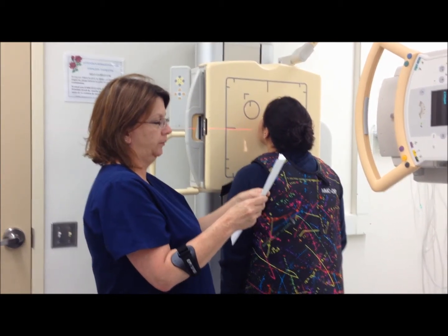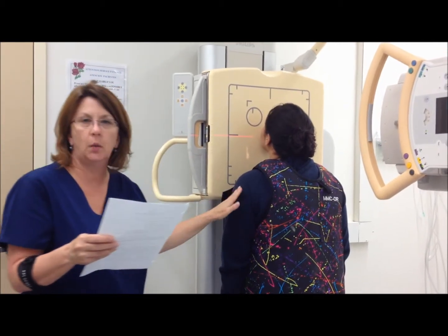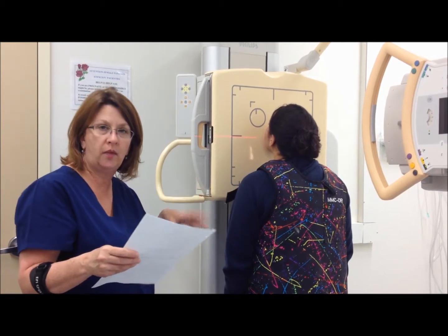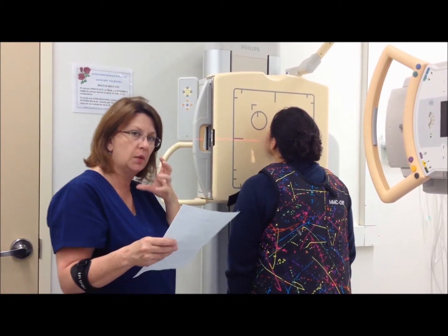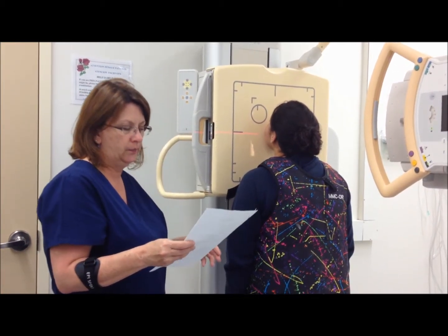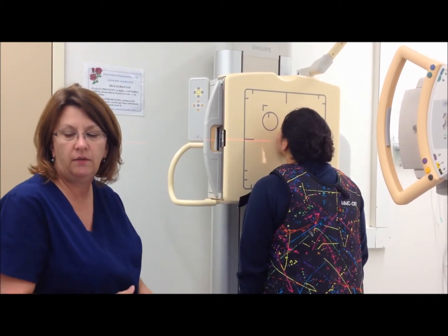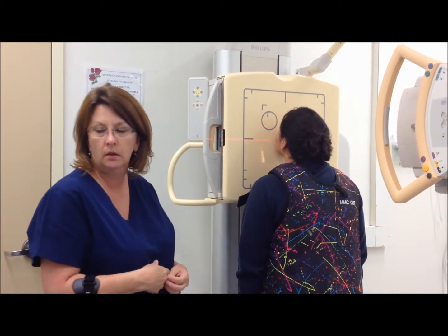The sinus we are going to be seeing with the Waters is the maxillary sinus. If we do an open mouth Waters, you will see the sphenoid. My technique for this will be 70 to 75 kVp at 15 to 20 mAs.